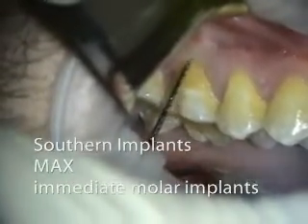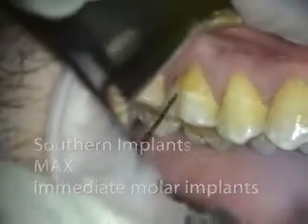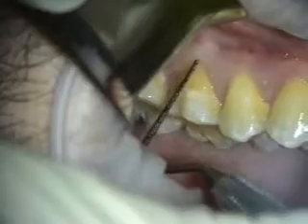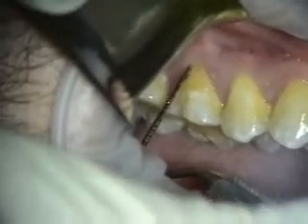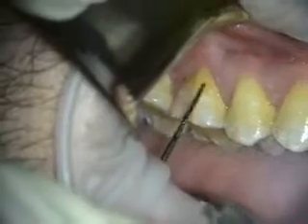The thing that's going to determine that is one, how much bone we have, and two, how deep we can get this osteotomy relative to the edge of bone. You need to get it a couple millimeters sub. So this recession may be the issue for us.